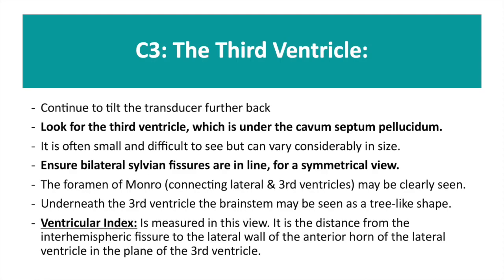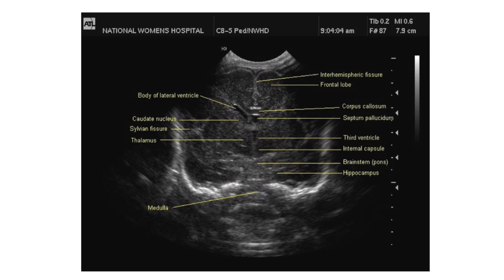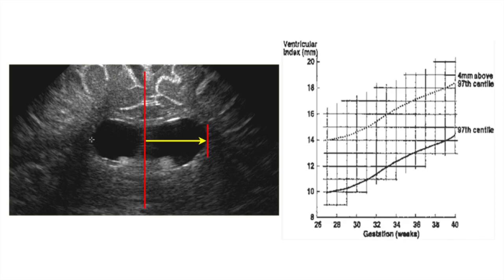The next image you want to obtain is C3, the third ventricle. This can be found under the cavum septum pellucidum. It is often small and can therefore be difficult to see. In a symmetrical view of this plane, a ventricular index can be measured — this is the distance from the inter-hemispheric fissure to the wall of the lateral ventricle. This should be plotted accordingly for the corrected gestational age. Values more than 4 mm above the 97th centile are indicative of significant ventricular dilatation.